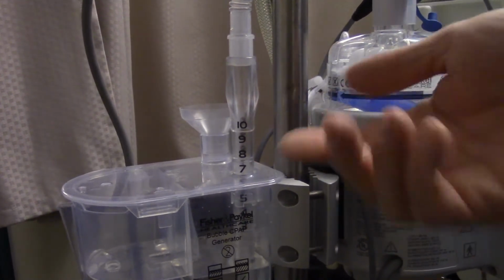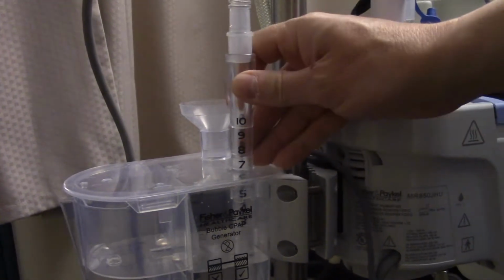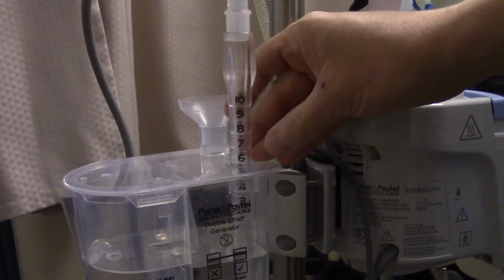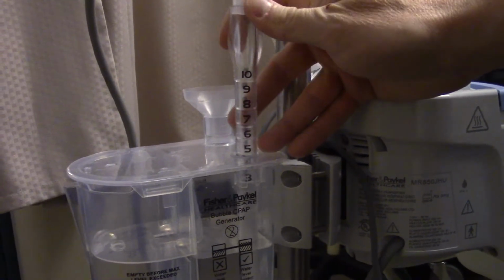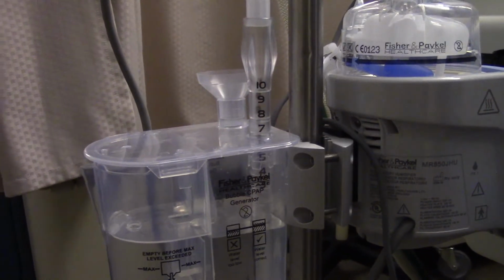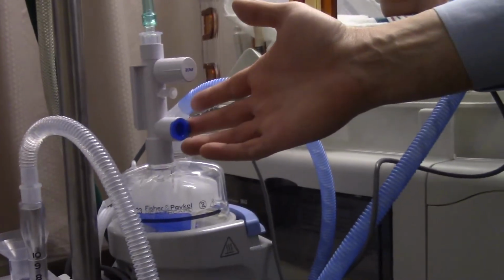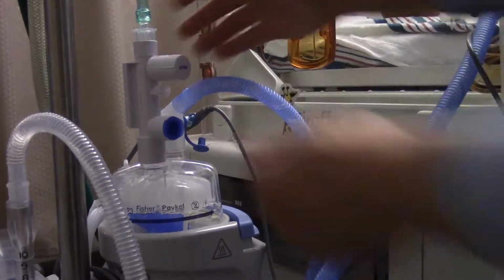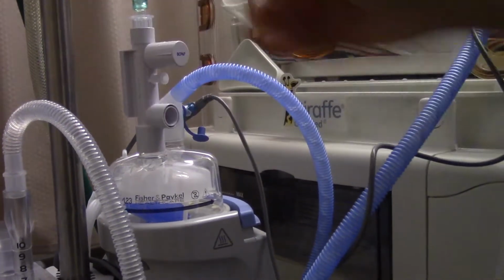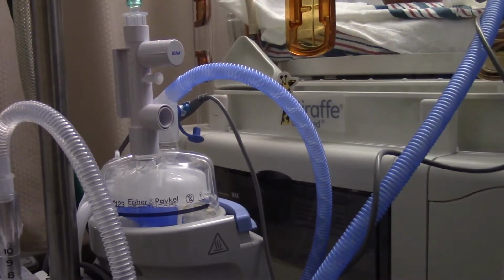In the demonstration in the video right here, you can see that it's set to 7. So right now that's a CPAP of 7. Pulling that stick up out of the water goes to 6, down to 5, and vice versa. We'll leave that at 7 because that's a good place to start. Other elements here: this tower has a pop-off valve on it, and this port opens up, and if you have an oxygen analyzer, the oxygen analyzer will go right inside of there.